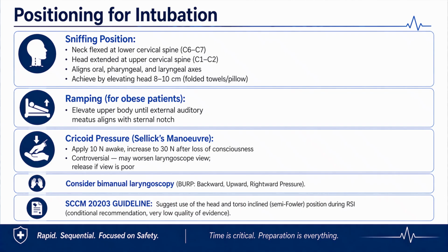Next is the BURP maneuver, that is the backward, upward, rightward manipulation of the glottis by a second person, the airway helper, which helps in improving the glottic view.